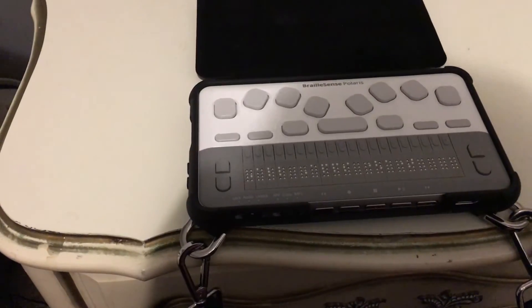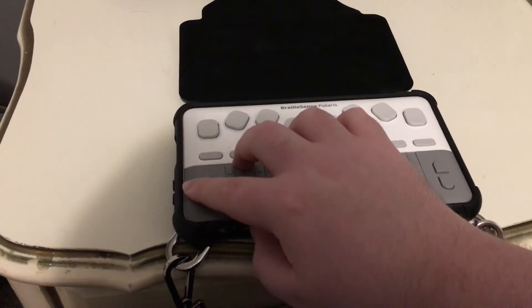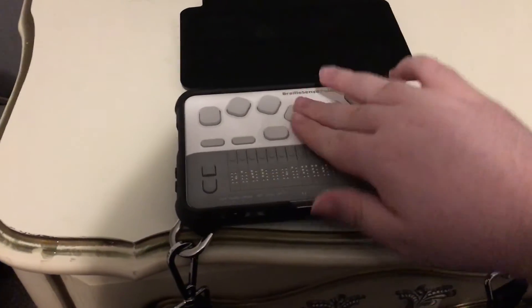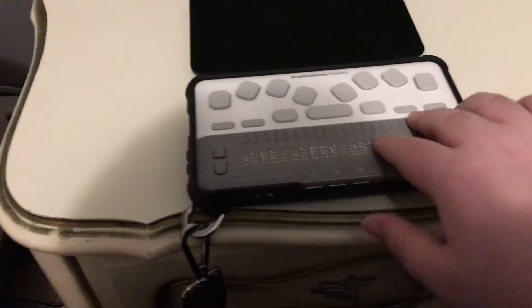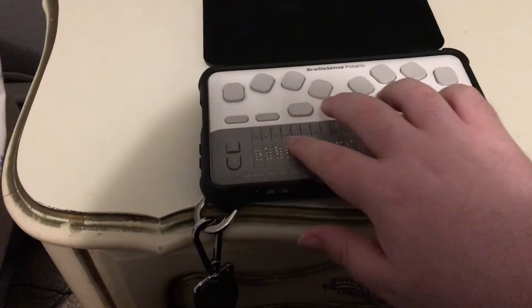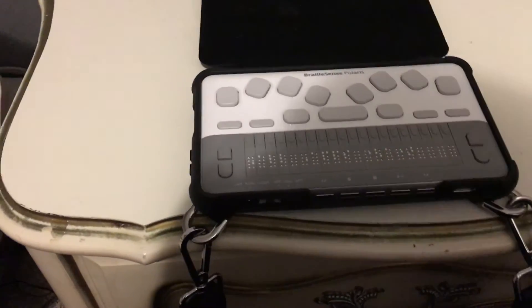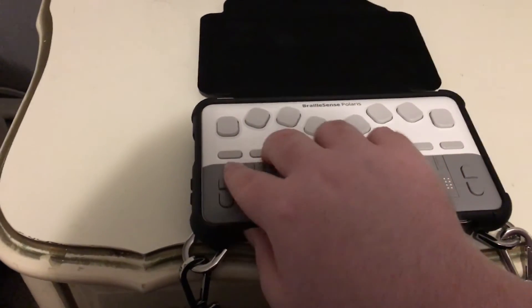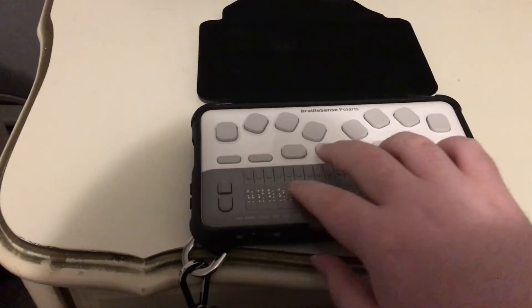Now I'll quickly show you how this little switch works for locking the keys. If I move it one to the left, it says 'Top panel locked,' so all top buttons are now locked. If I move it one more to the left, it says 'All keys locked,' so now everything is locked — I can't even power the unit down. This is really great if you need to put it in a bag so it won't accidentally turn on. Moving it back unlocks the keys.